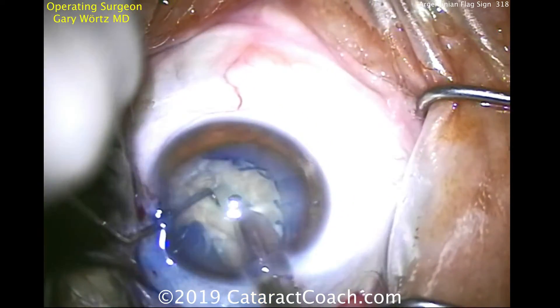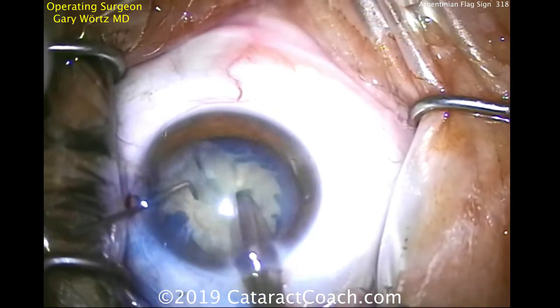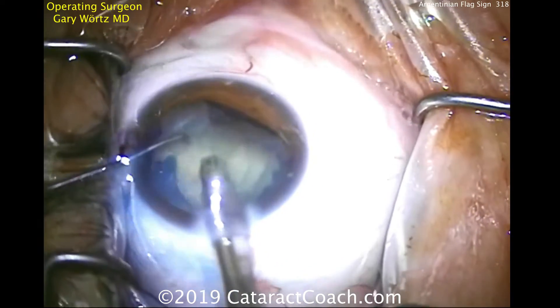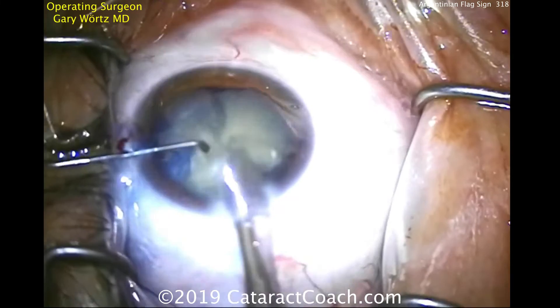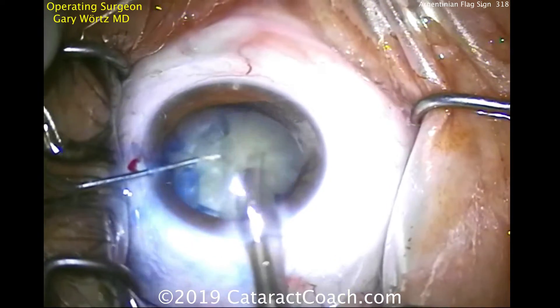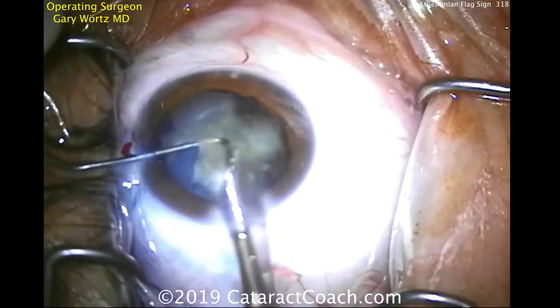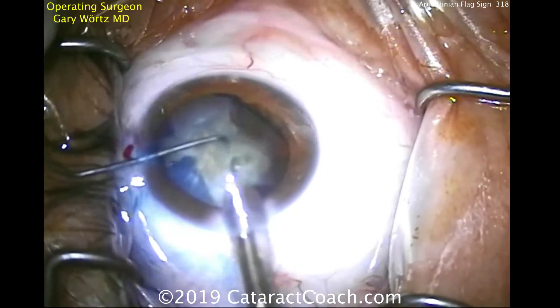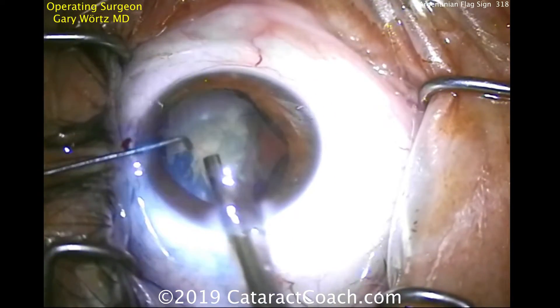So doing a stop and chop technique, grooving, getting the nucleus split. Notice how he's very gentle — he doesn't do a forceful split of the nucleus. That's a very important move. A forceful split there may put enough stress to cause that rip in the capsule to extend all the way to the posterior capsule, which could damage it. So the goal here is to keep that posterior capsule intact, of course.